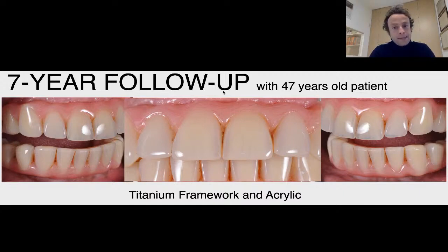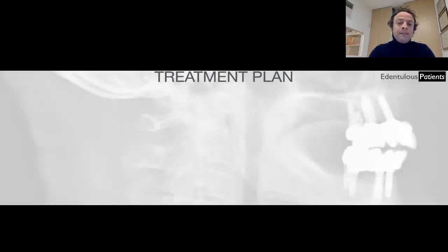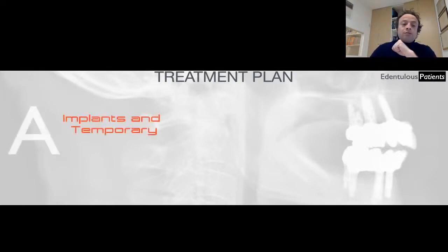It is also expensive. And so I think that we cannot promote this kind of rehabilitation as final, because it's the word final that can put us in a bad situation when the patient maybe could have problems in the future with some complication with the prosthesis. And this is the reason why in my clinic I like to approach the full edentulous patient with this kind of strategy.